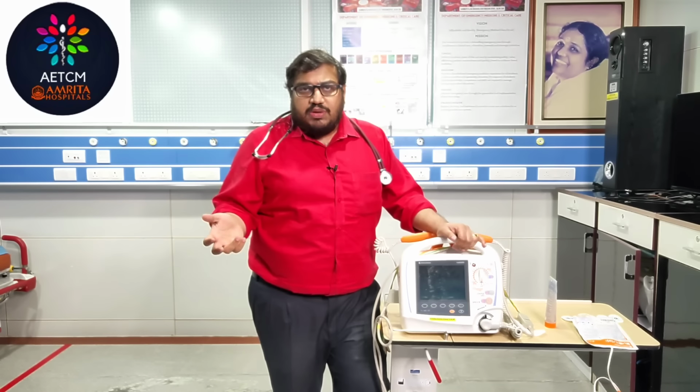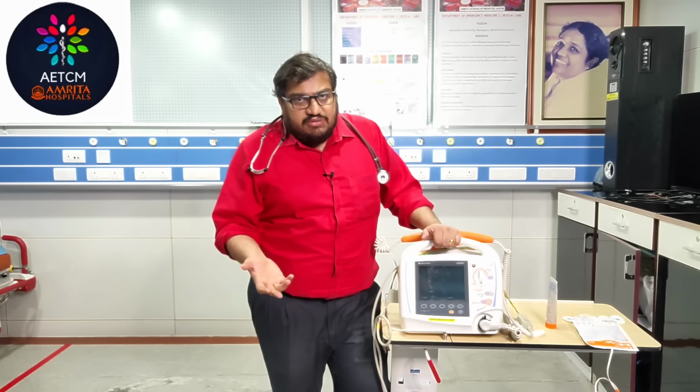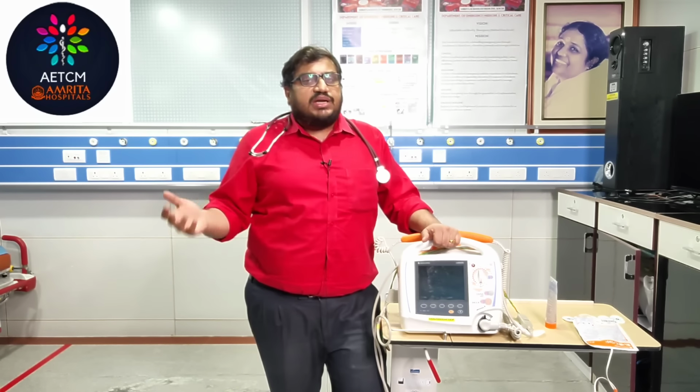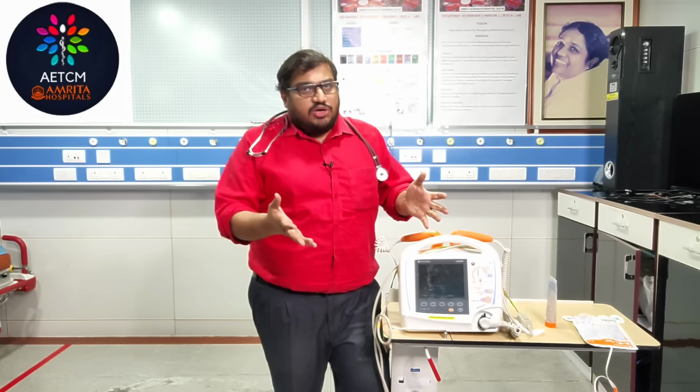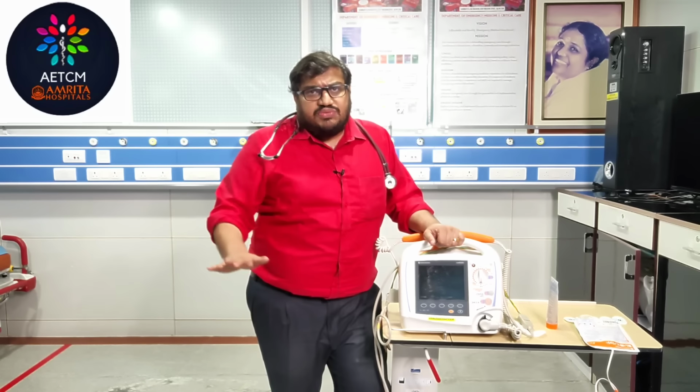If you are able to remember, 200 joules of energy is for a biphasic defibrillator. In case of a monophasic defibrillator, it is 300 to 360 joules of energy. And you are delivering the shock. That's it. So that is regarding your defibrillation, only in case of a cardiac arrest.